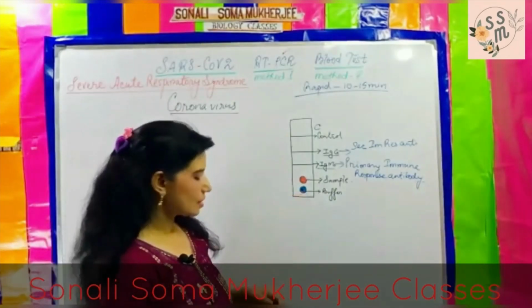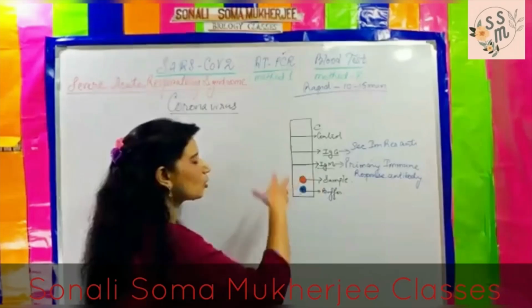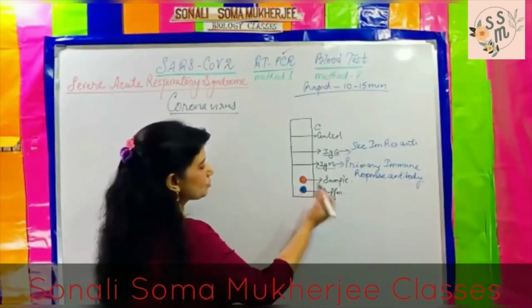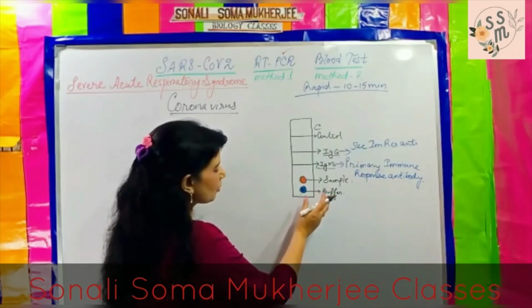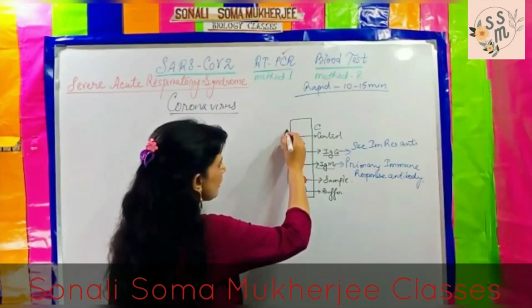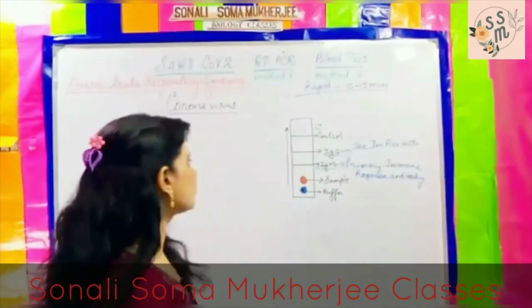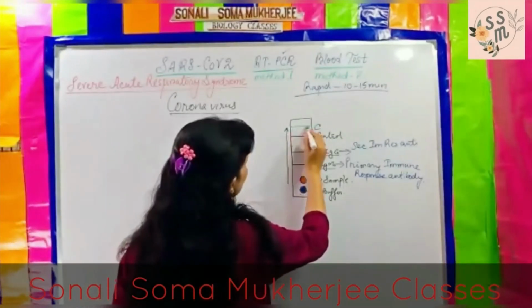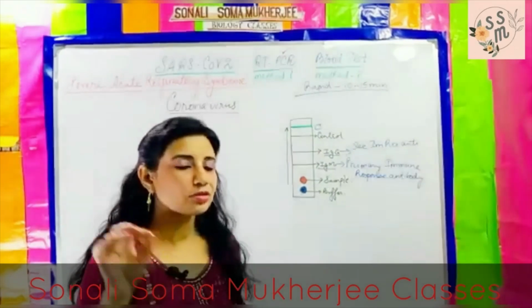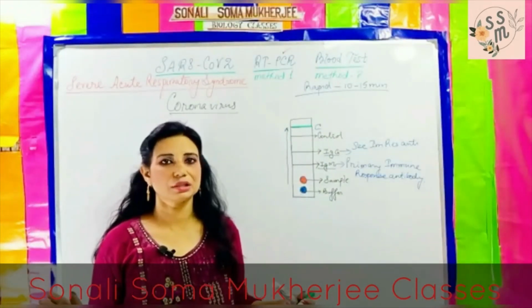What happens is, due to capillary action, the buffer carries the entire blood components, including the antibodies, and it reaches the point where the control line is there. If there is a control line, that signifies that your kit is correct and the test has already run.